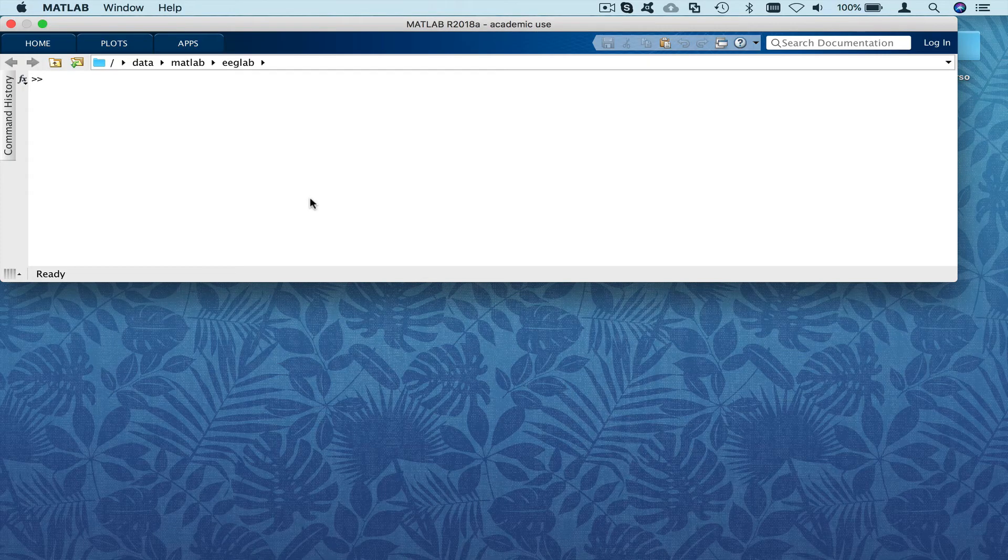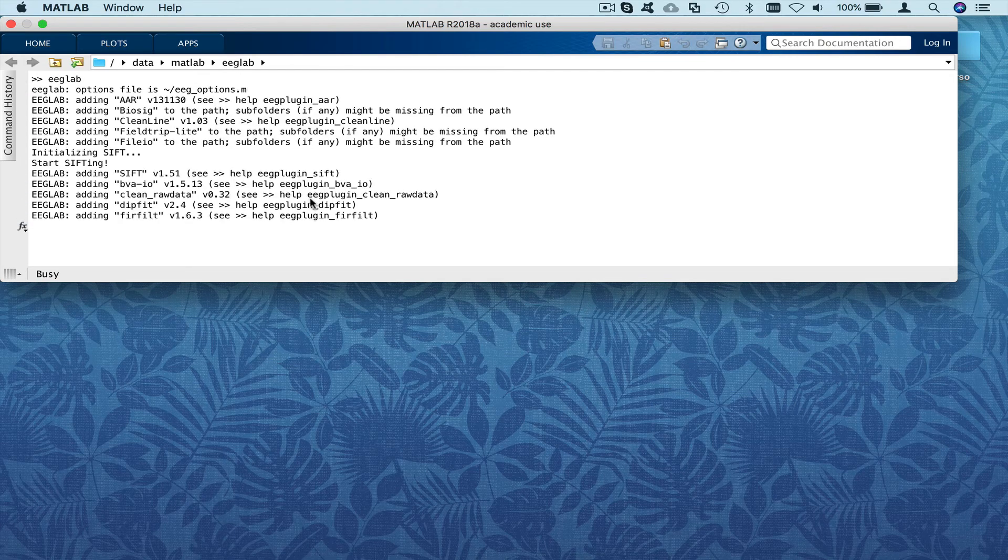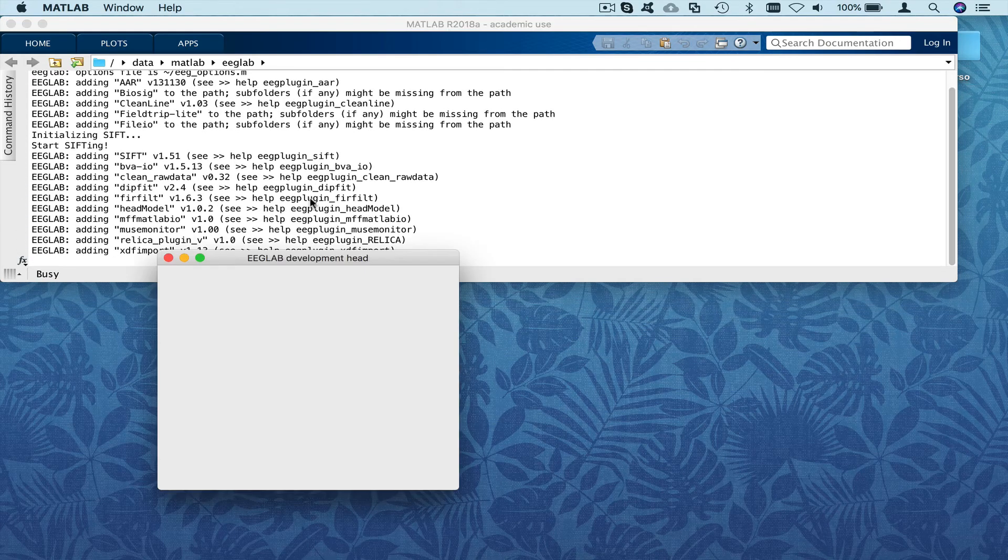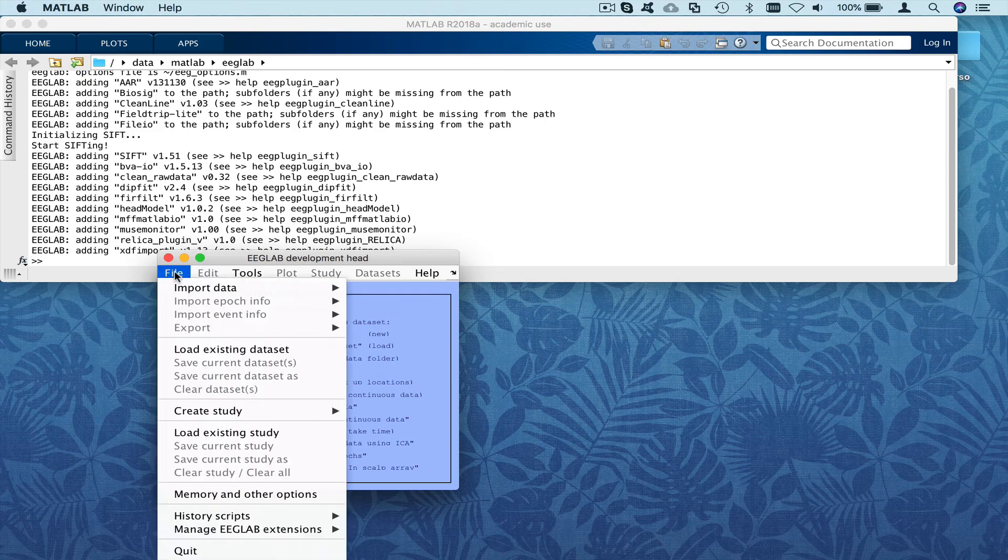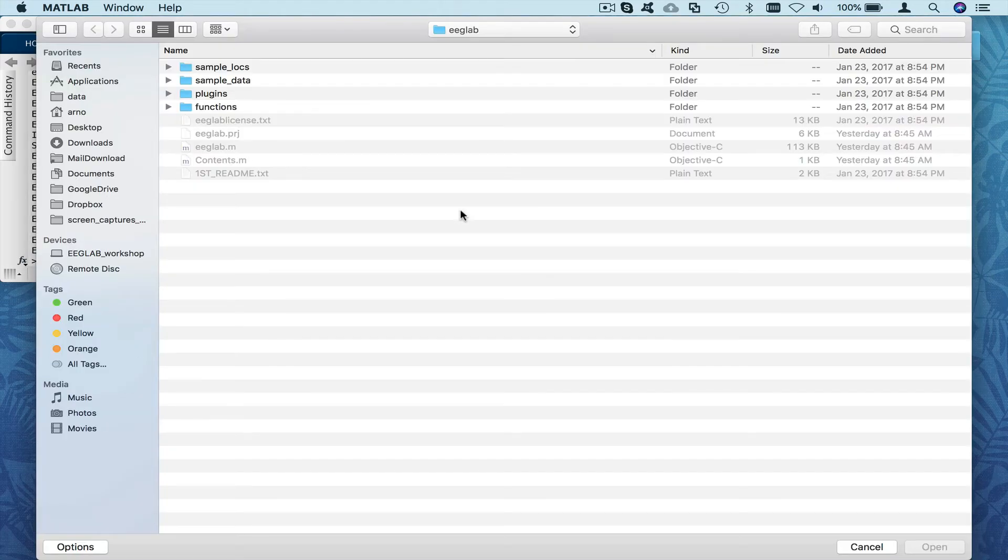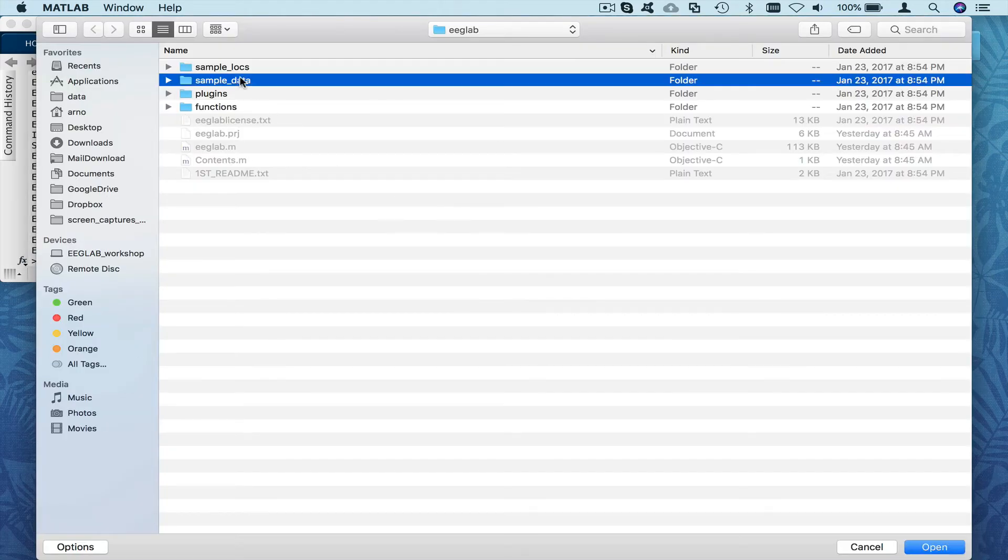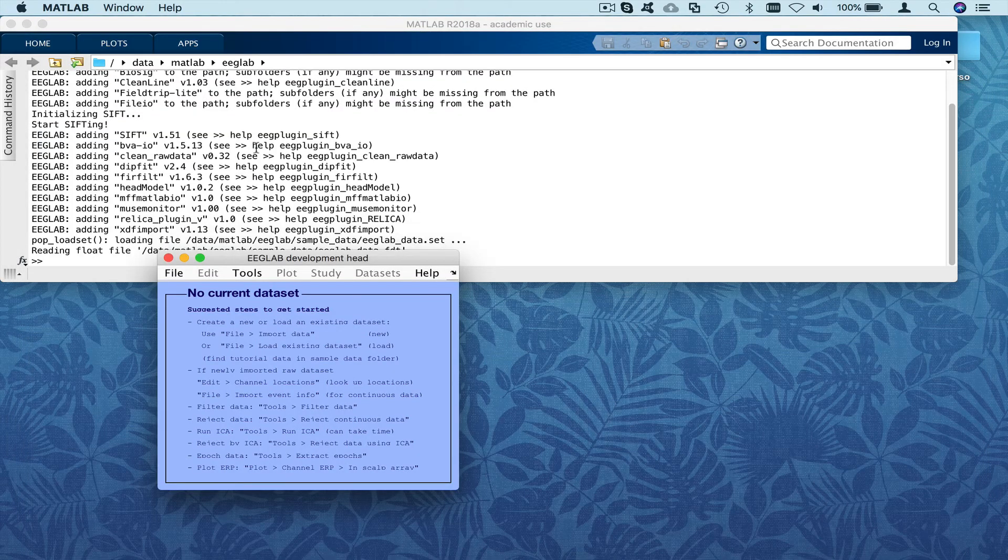So here I'll do a simple live demo, again using the same continuous dataset in the sample data folder. File, load dataset in the sample data folder of EEGLAB, that's the one.